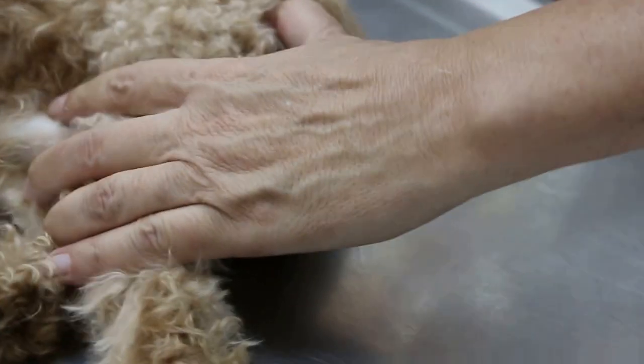Now the dog has sedation so it can't feel the pain as much, but there's still some pain. Now I turn it over to the other side — the other hip — for comparison.